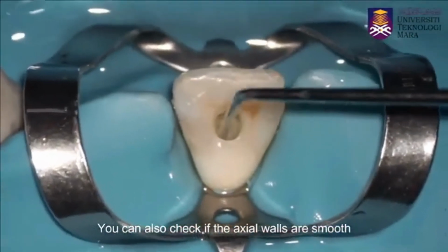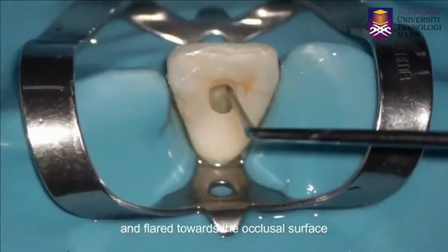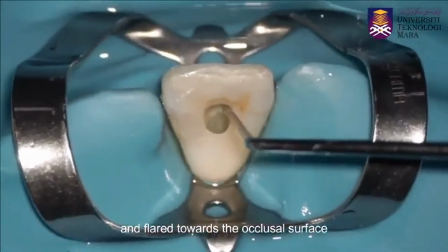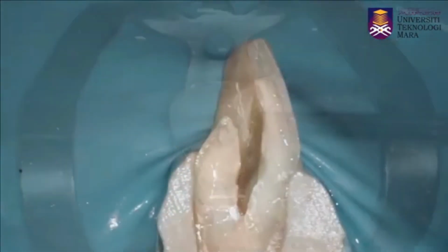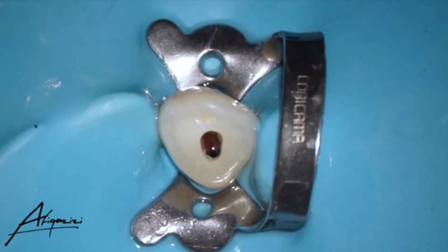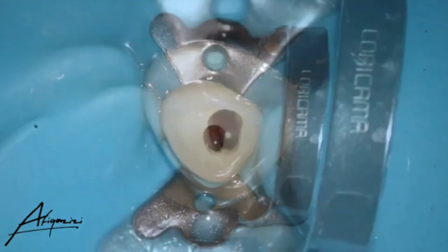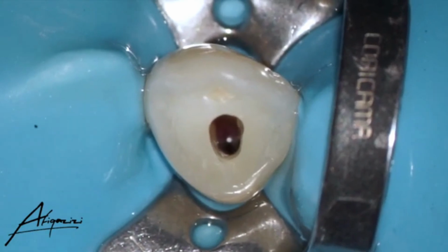When the pulp horns are present, the shape is a rounded triangle, and if the pulp horns are missing, then the shape is oval. Since the maxillary canine has no pulp horns, the access cavity is oval in shape, with the greater diameter being labiopalatal.